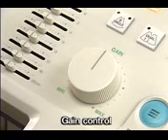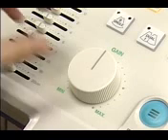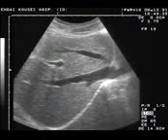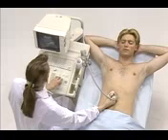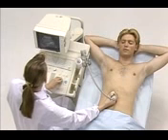Next is the adjustment of the gain knob. This gain knob is used to control the overall strength of the echoes. You will operate this knob most frequently. If the gain is too high, noise or artifacts will appear. Then the images obtained have poor resolution. On the contrary, if gain is too low, important information may be obscured or deleted. So, adjust the gain knob carefully depending on the patient's body habitus and region to be scanned.